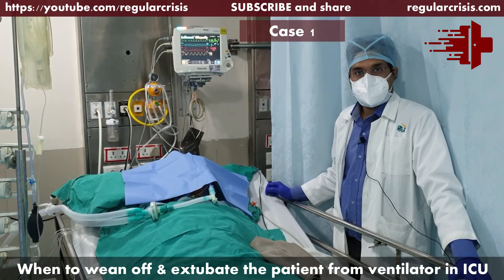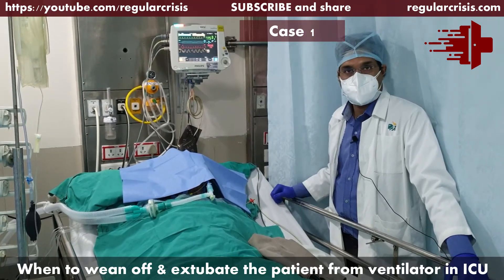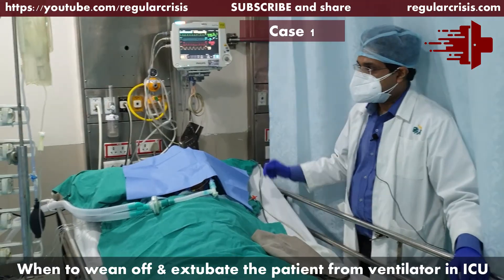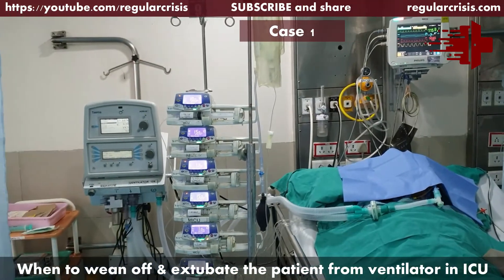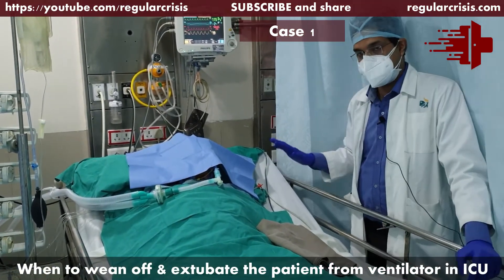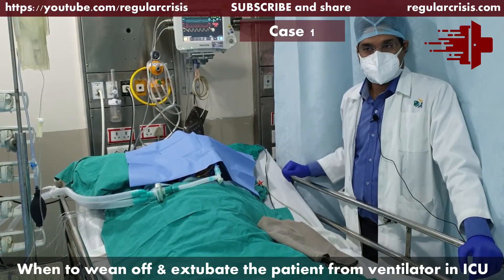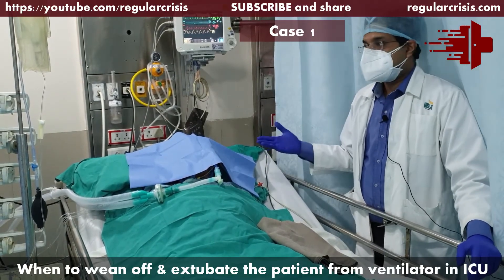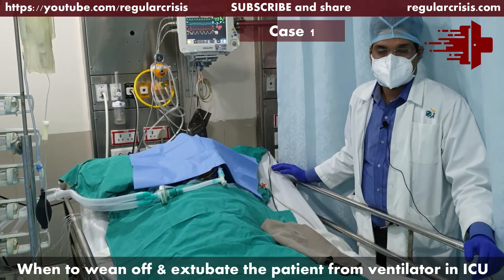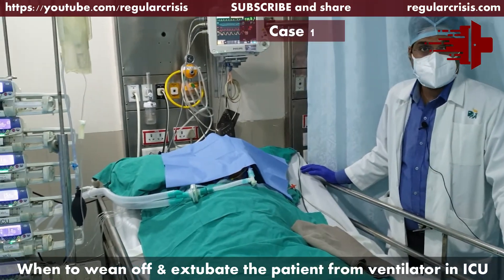Currently the chest is not good — you can see the FiO2 requirement is 100%, and even on 100% she is not able to maintain oxygenation. So the primary pathology has not improved at all — in fact it has deteriorated. Second, the patient is on sedation and is not conscious, not following commands, not oriented — so that criteria is not fulfilled either. Third, hemodynamic stability.